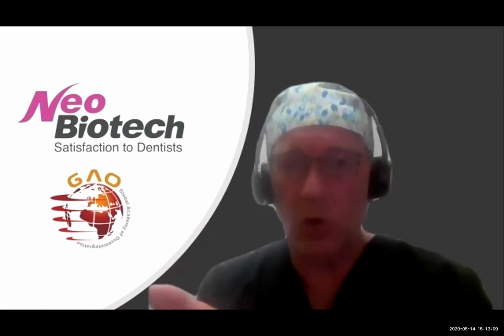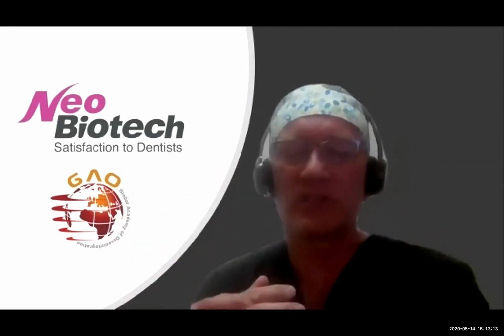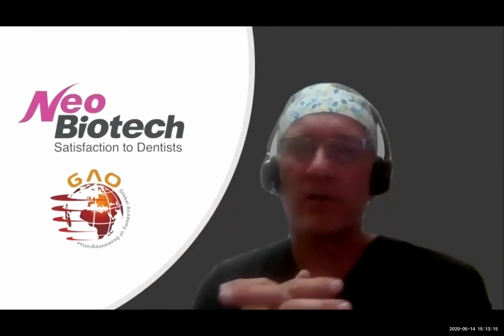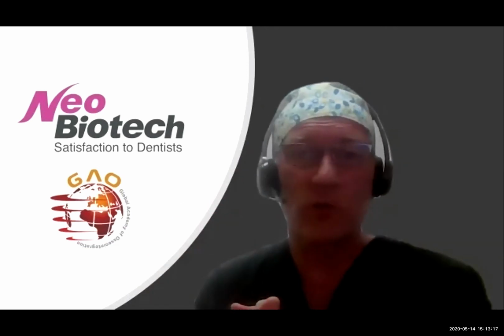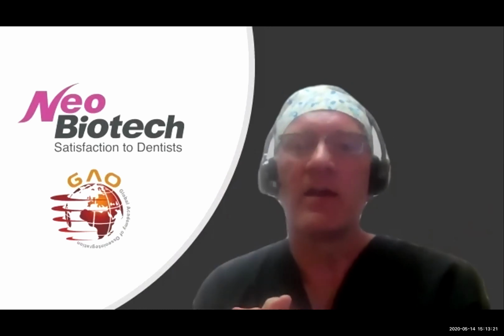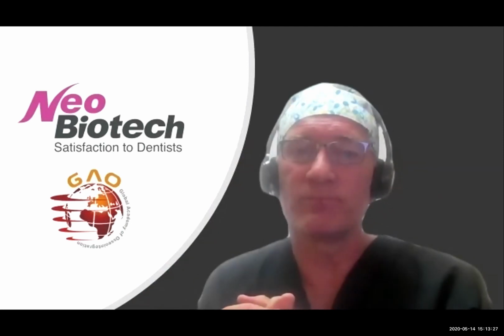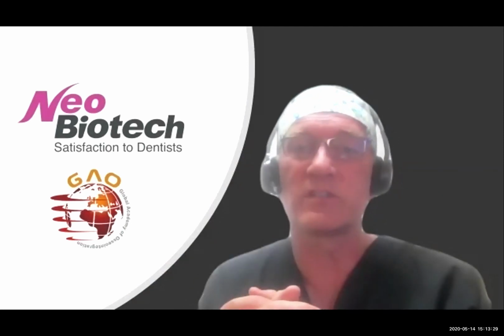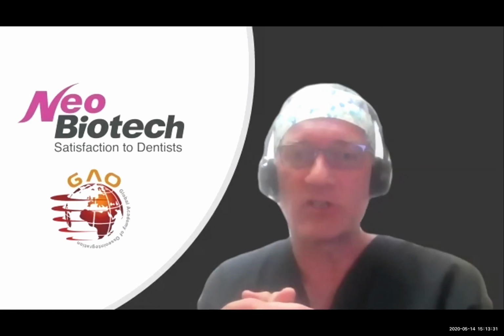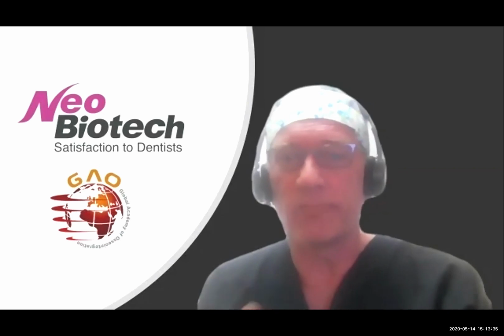So, John, your question about that is a good one, because typically the larger particle size is going to help hold your space better. With this, I don't need a space maintainer, because I've got my resorbable membrane, I've got my periosteum that's there, and I've got the bone that's underneath there. And so that is what's led me away from a larger particle size to a powder size. Good question, though. Let's see, are there other questions?